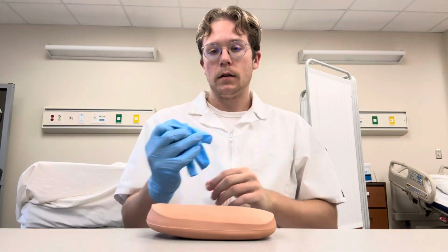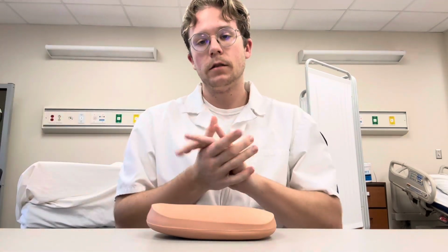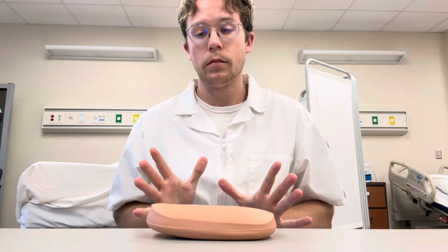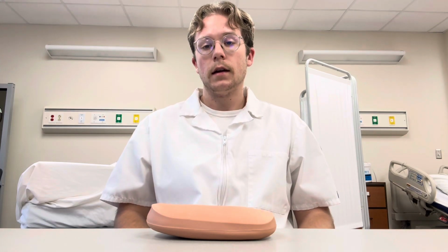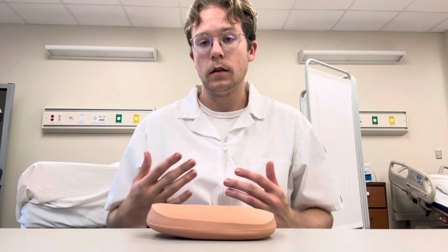Take off our gloves. Perform our hand hygiene once more, and then we'll document everything that happened in the procedure, how the patient tolerated it, the injection site that we used, and the blood glucose readings before, and we'll probably take one not too long after.